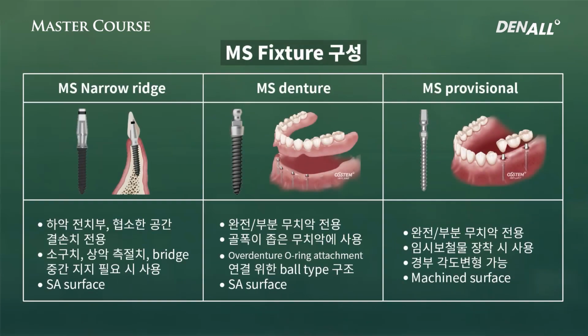Let's summarize what was discussed about MS implant. I'm sure it'll be easier to understand if you look at the screen. There are 3 main types of MS implant. Please remember.